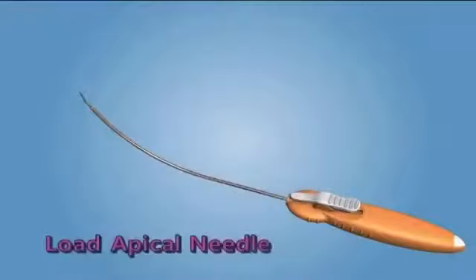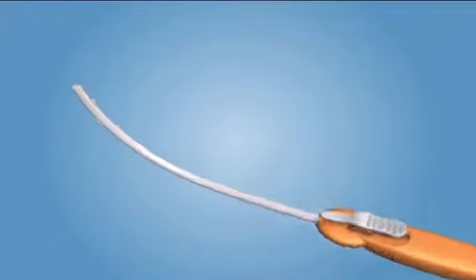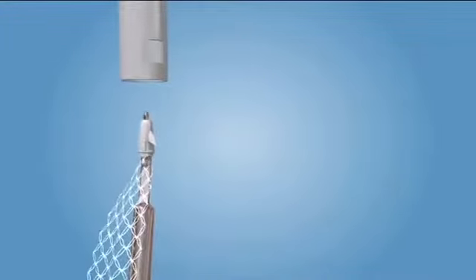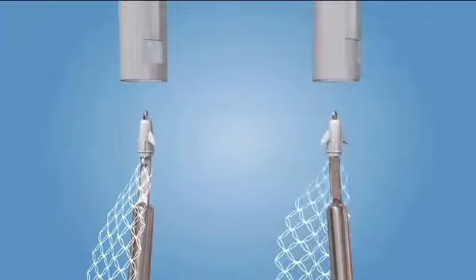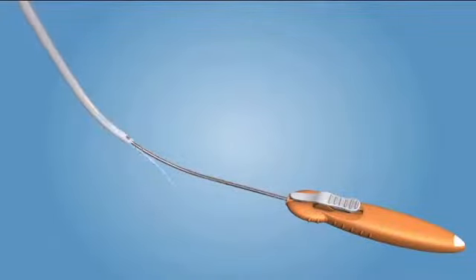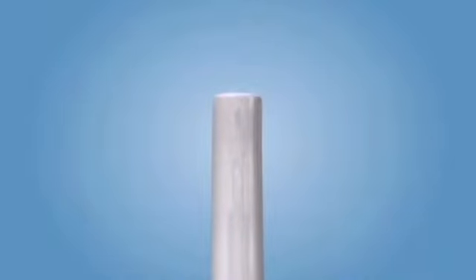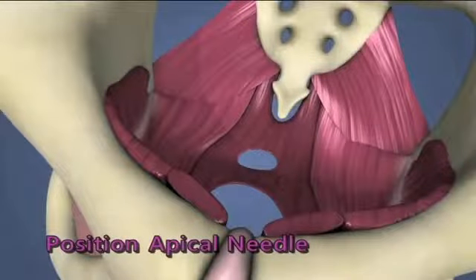Loading the apical needle. Insert the apical needle into the self-fixating tip on an apical fixation arm. When inserted, the needle tip will be visible through the end of the fixation tip, and the tines will always be parallel relative to the curvature of the needle. Once the apical fixation arm is attached, slide the plastic sheath, with window closest to the handle, over the needle until a click is heard. Verify the entire fixation arm is covered and the needle tip is not protruding from the distal end of the sheath.